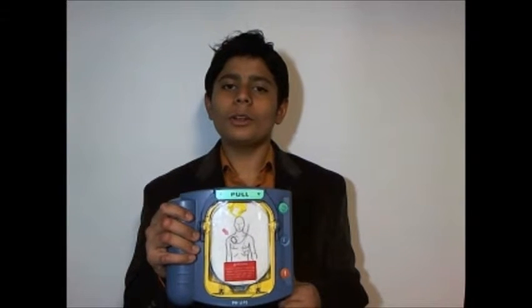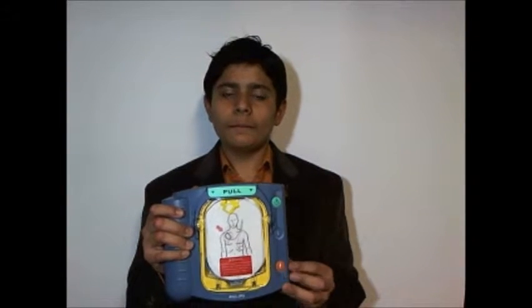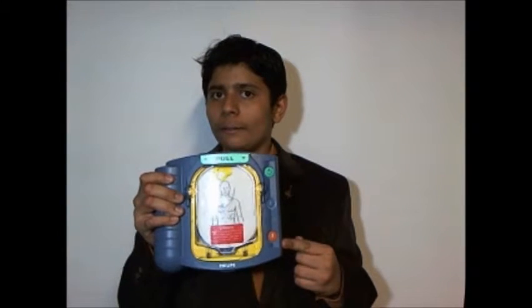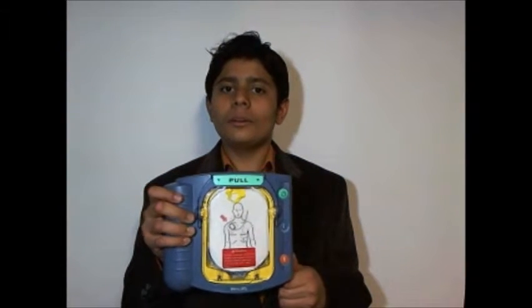Hello there again, and here's the defibrillator. The three main parts in this device are the three buttons you see here to the right. The first button, the ready to go green button, powers on the device in the first place. Then we have the information blue button, which delivers additional information to you. Then you see this flashing orange button, which tells you a shock is advised. And when you press this button, a shock will be delivered.